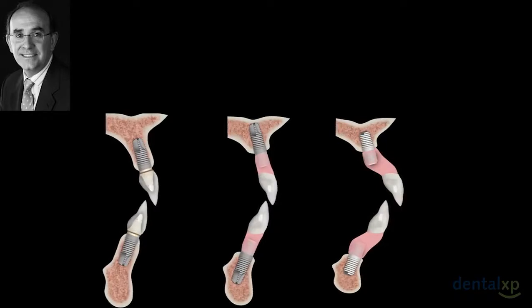The last speaker was talking about the pink papilla, but it is also very important to explain to our patient what our idea is. Because in the posterior area, I think this situation is very acceptable. And when we have a very severe atrophy, this situation is also very acceptable for our patients, and we can finish the restoration with a fixed prosthesis, and I always try to avoid overdentures.